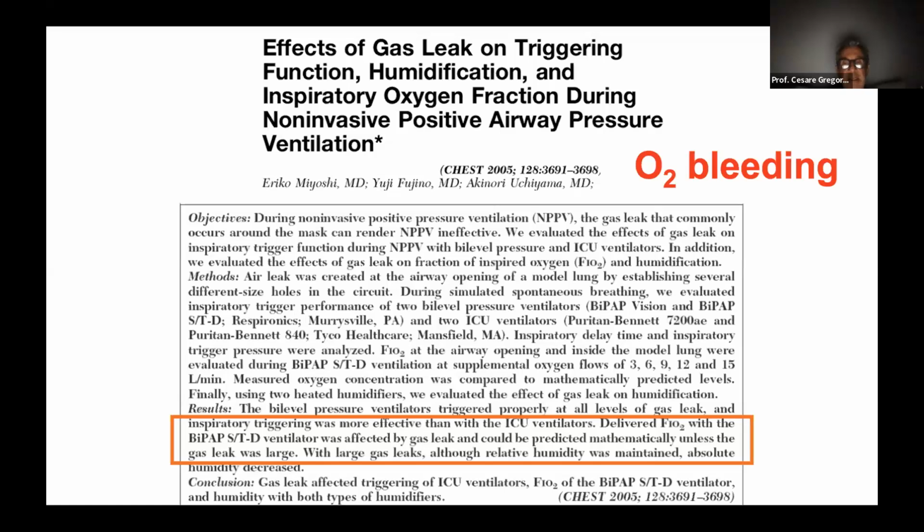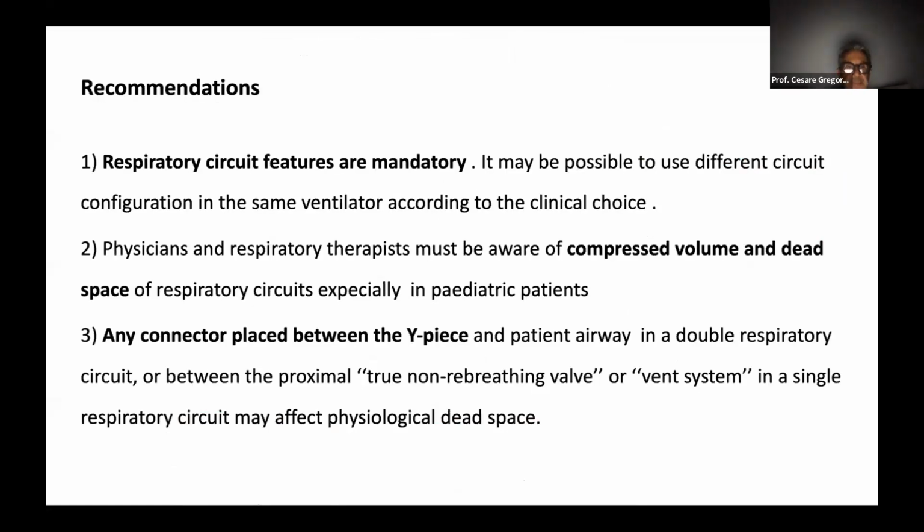The higher the leaks, the more oxygen is wasted through the venting system, and the greater the need for oxygen to feed the ventilator. So what are the recommendations? Respiratory circuit features are mandatory.